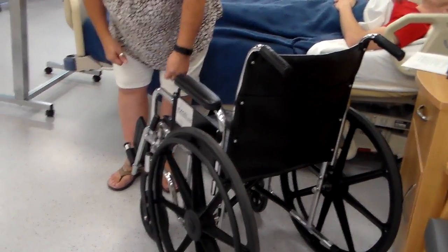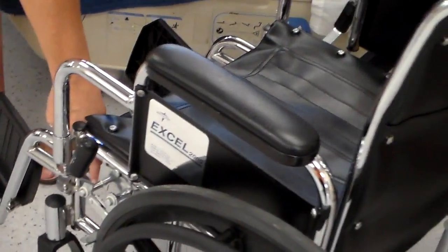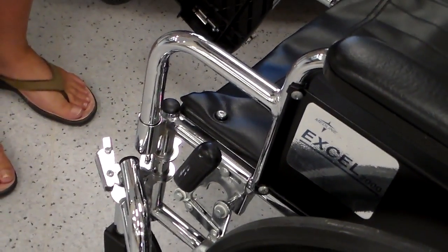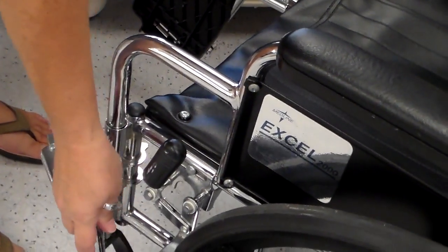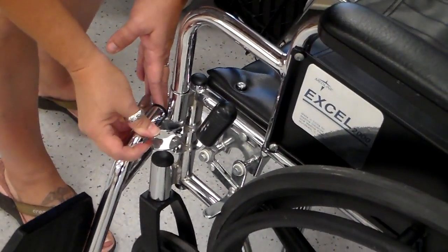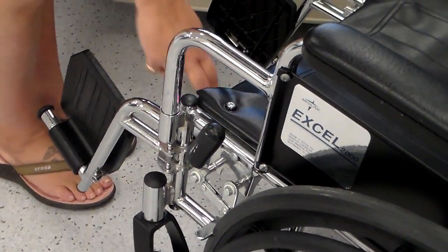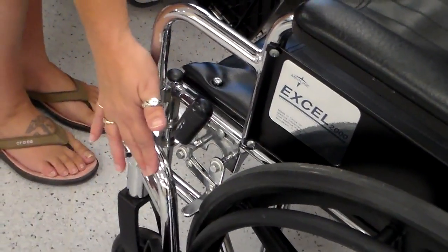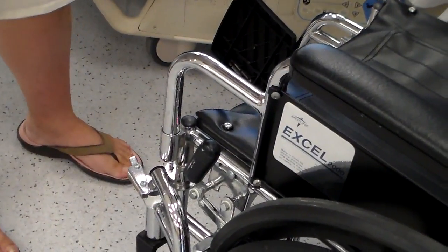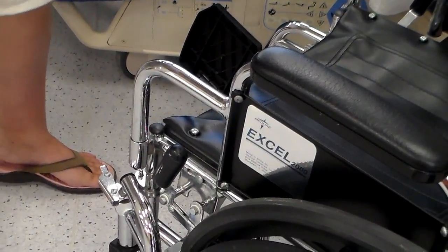And come right over here, I'll show you. There's a button on the side of the wheelchair, right in here, that you pull, and that just slides right out of there, okay? You can also lift up at this point, and that comes right off, okay? So that goes right on here, and then slides back, and it locks into place. To remove it, you push, and right out. Now each wheelchair is going to be a little bit different, but the mechanism's about the same. Same location, just might be a lift up instead of a lift out, okay?